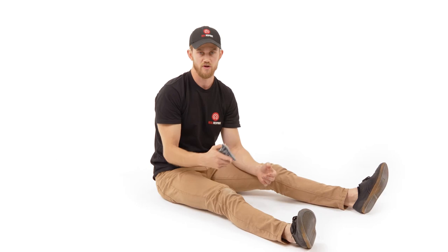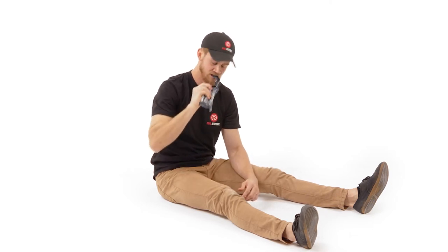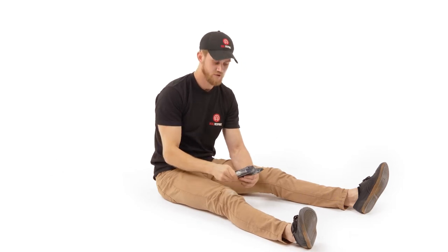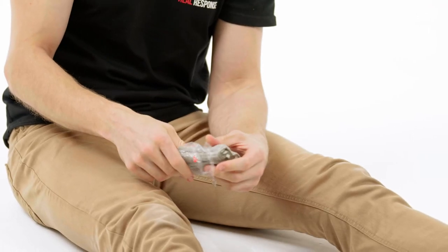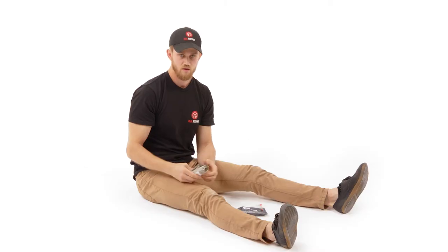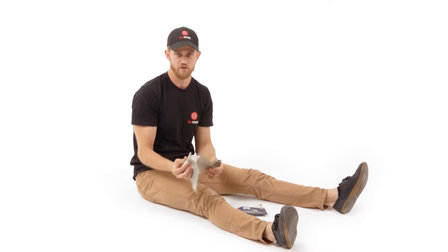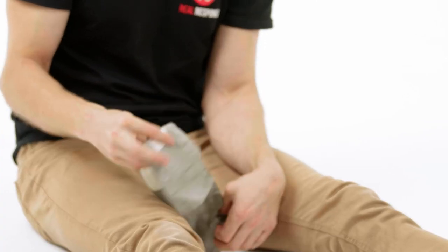Whilst you're doing that, you can then use your other hand, or you might have to take this opportunity to lift your hand up in order to get out your emergency bandage. From here, you can either use your other hand if it is functional, but if not, use your teeth to open up the bandage itself. From here you're then opening up the bandage from its sealed package on the inside.